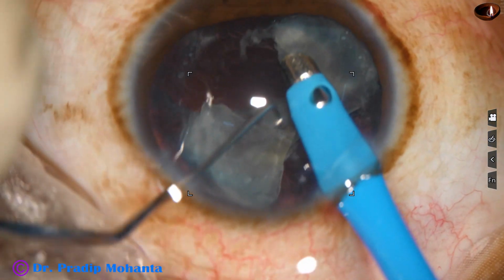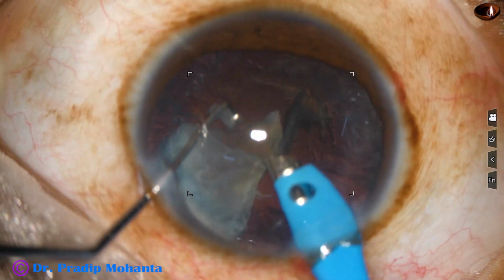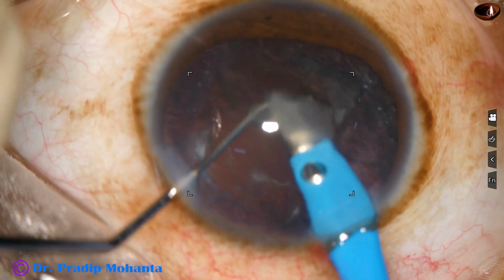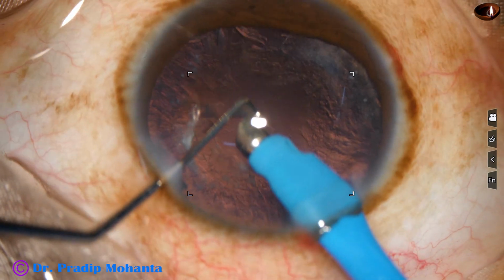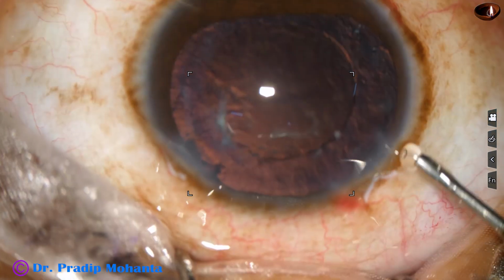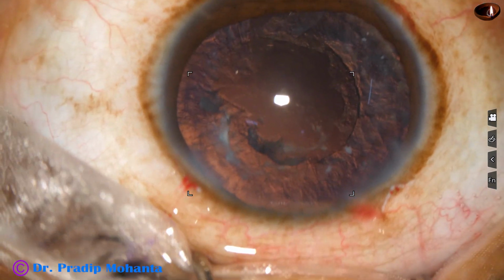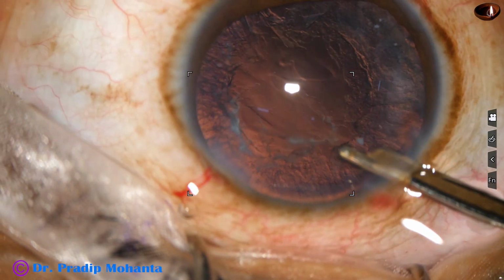This is the other heminucleus. It is divided into two pieces. Each nuclear piece is emulsified. The anterior capsule was stable and the posterior capsule behavior was okay. It didn't tend to come to the phaco tip. That means the zonule is not very weak in this case. Because there is trauma, some zonular fibers may be torn, but the remaining zonular fibers are really strong.